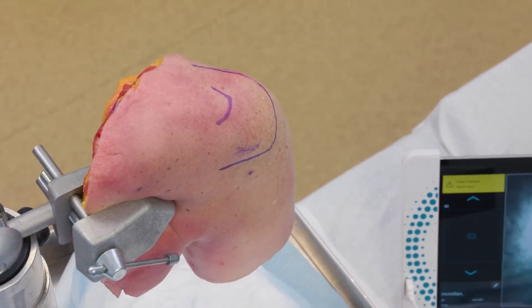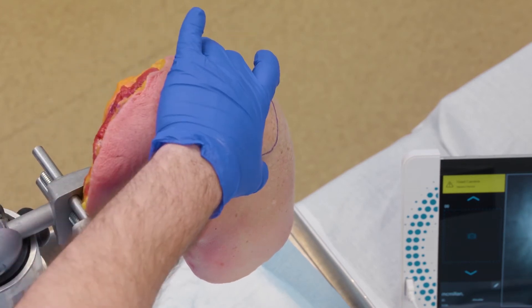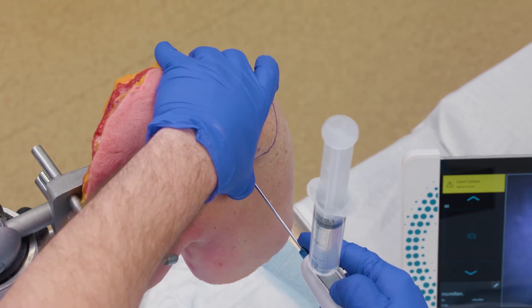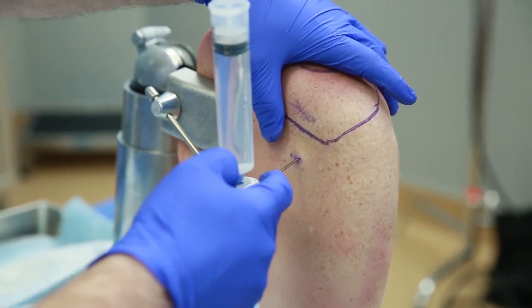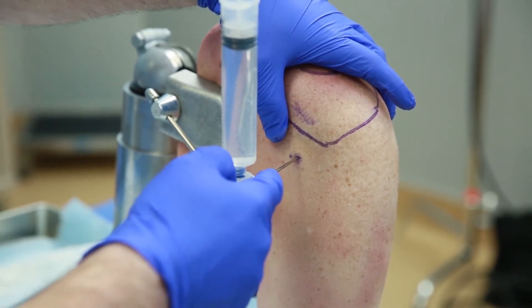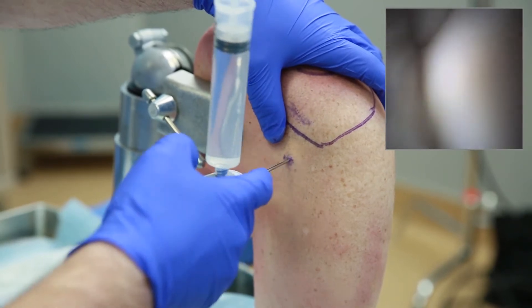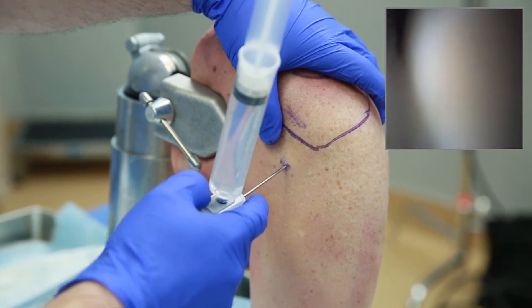Once my patient's been anesthetized, I'll come in, put my finger on the coracoid, confirm my soft spot in a sterile manner, and direct my eye into the joint aiming for that coracoid. As I enter in, I'm going to aim right for my coracoid and get up over top of the humeral head. As I access the joint, I'll retract my optics and allow them to come out.